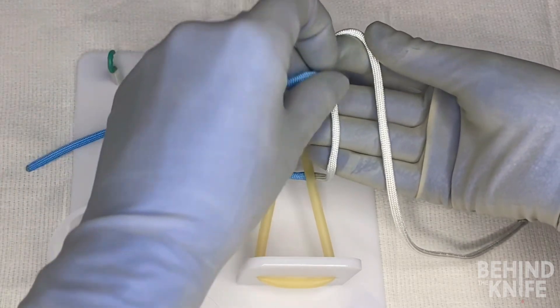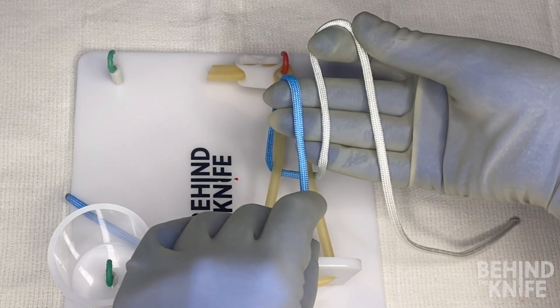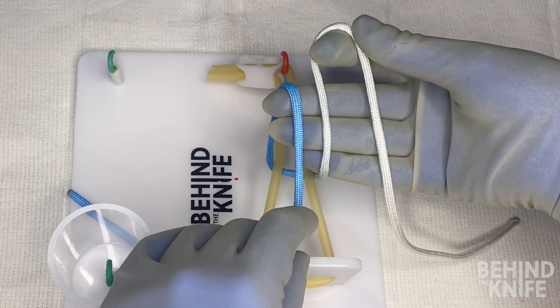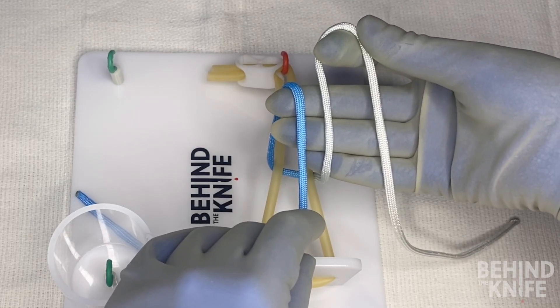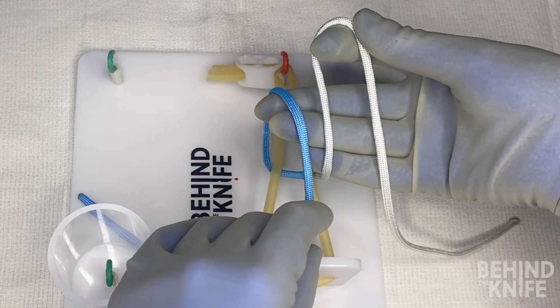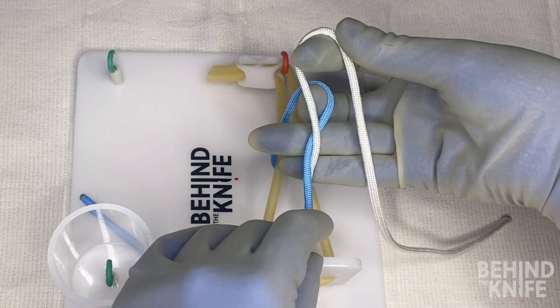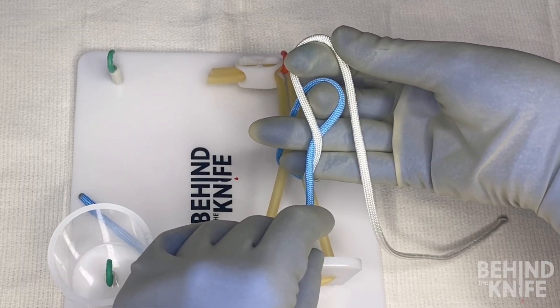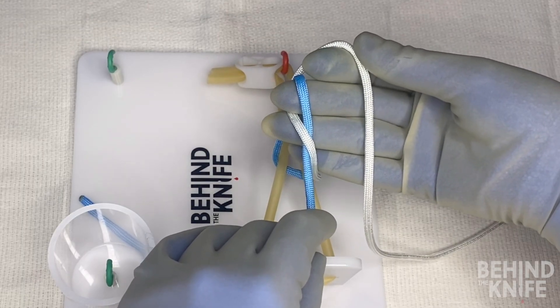Next, I'm going to take the left side of my string and drape it over these three fingers as well, so the two sides of the string are parallel. From here, I'm going to take my middle finger and pull the blue end of my string under the white string and over the top, so it looks something like this.